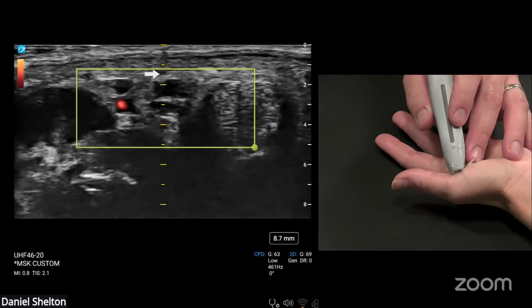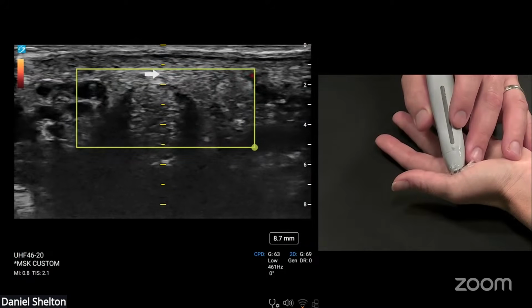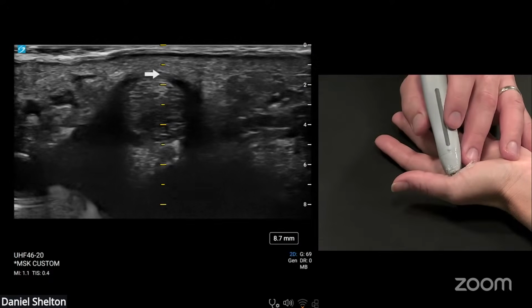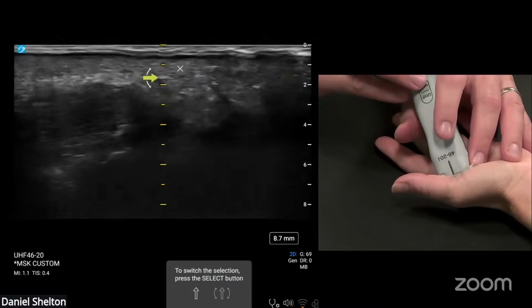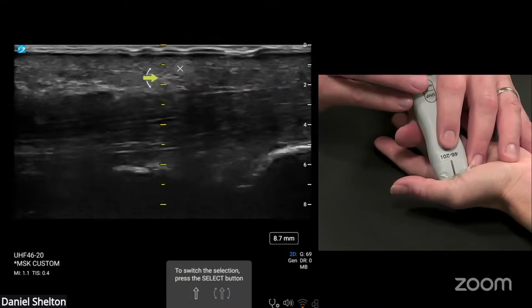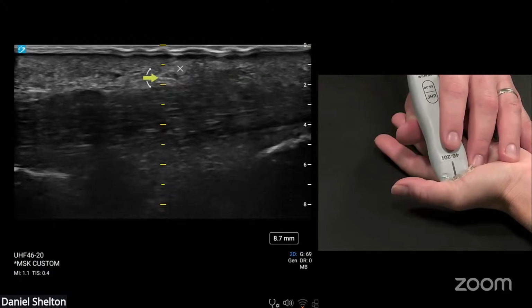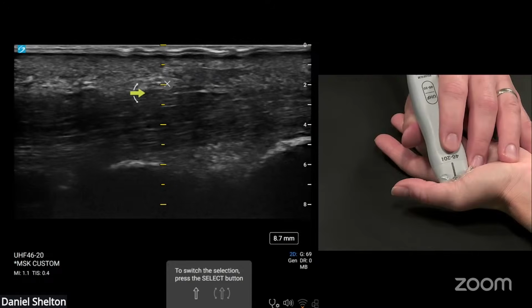There we go. So marking your vessels, going right down the middle, parking your needle under the shadow, right where the arrow is. And then you would rotate your transducer, confirming you're not beveled down in a tendon, staying above the tendon. But here's our A1 pulley right here. Looks like a little airplane wing.